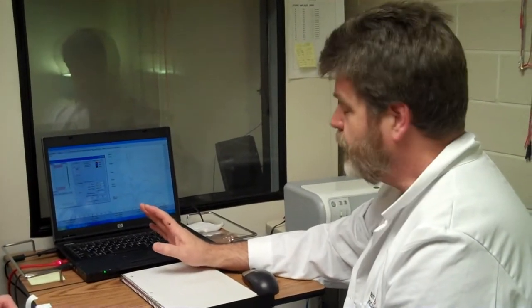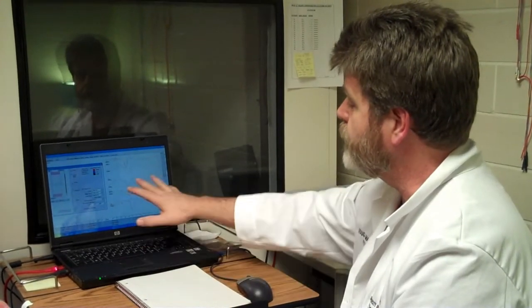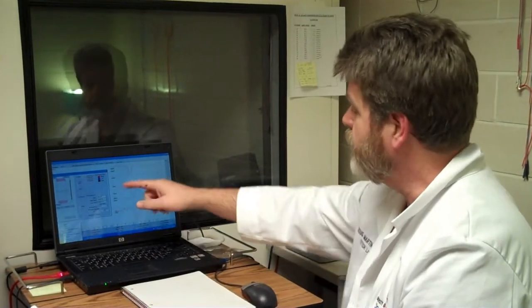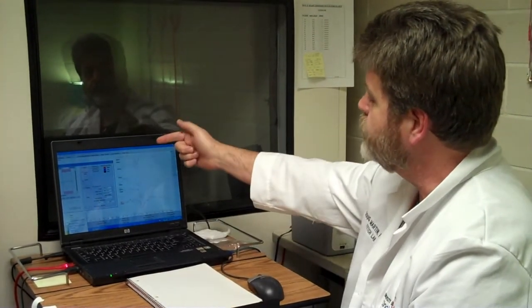When we have Q in the booth, we have electrodes on Q's head, and what we're doing is presenting sounds into the ears and simply recording neural activity from the scalp in response to those sounds. We're plotting those recordings on this particular screen, and what we are looking for are individual peaks that show up on the tracing that allow us to follow that sound as it travels from the ear up to the brain.